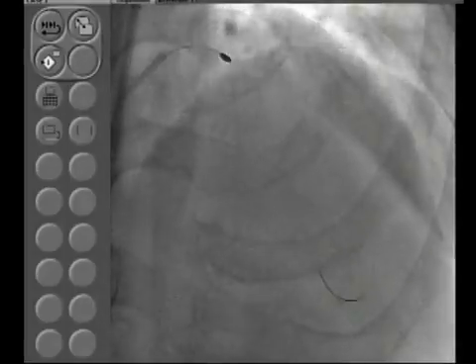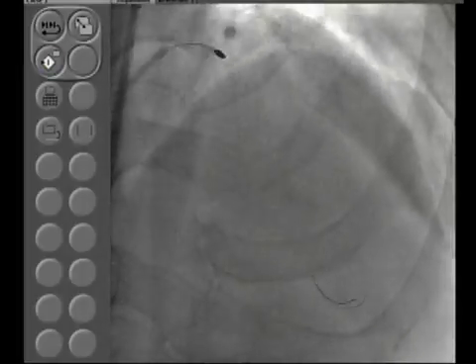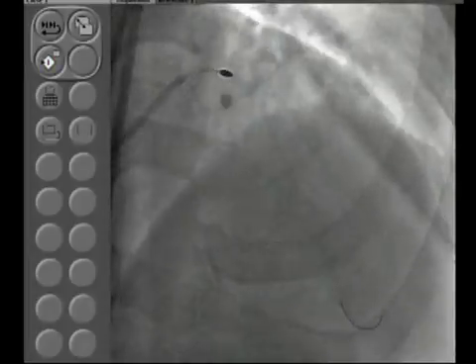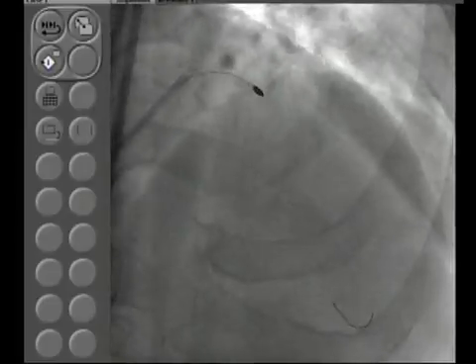Lower speeds. And this patient is tolerating the procedure very well. His heart rate, blood pressure, everything is stable. While we are doing this kind of ablation, at any stage, if we see the patient has hemodynamic compromise, that's an indication that you may have to downsize the burr.